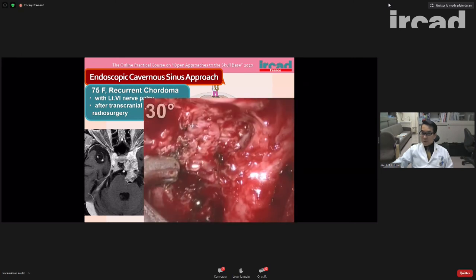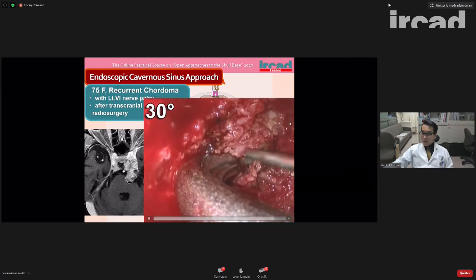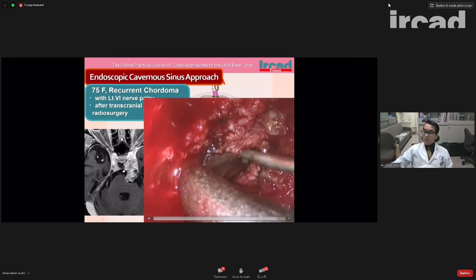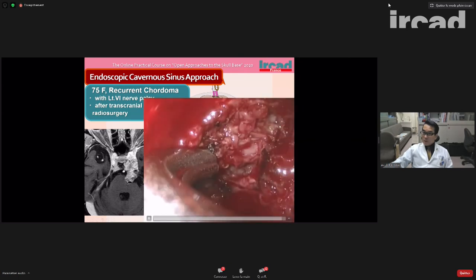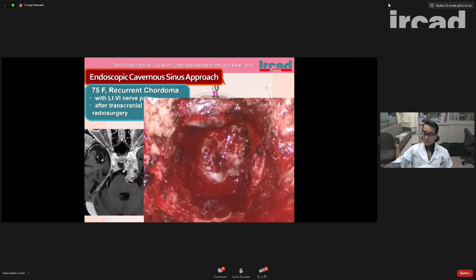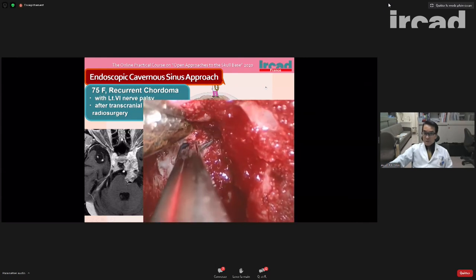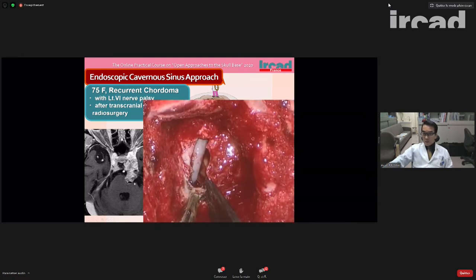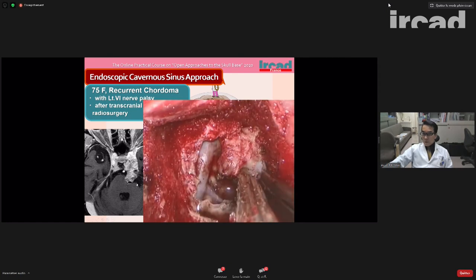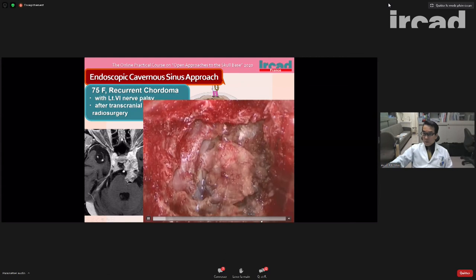And then we switch to the 30-degree endoscope, and we can see the lateral membrane of the cavernous sinus here. Maybe these components are the trigeminal nerve or something. Then going to the intracranial space too. So this tumor is extending into the intradural space, so we have to remove this with the dura mater.